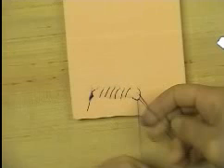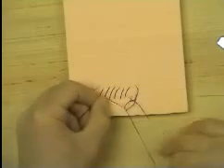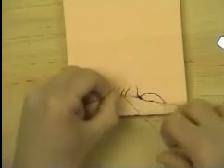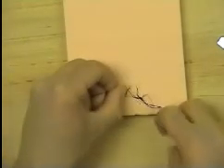The bite of the suture is then handed to the fingers through the loop, creating a second loop. The first loop is tightened down by a seesaw action between the two hands holding the new loop and the single strand.